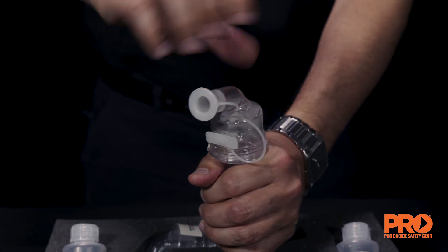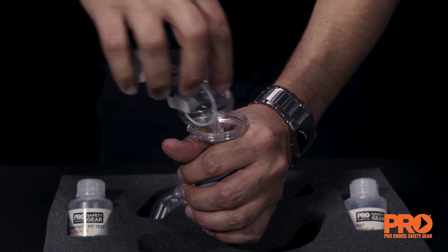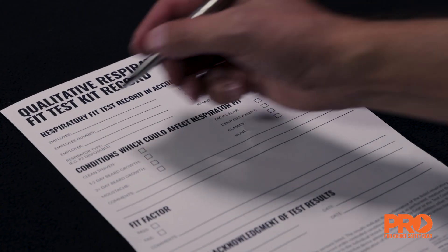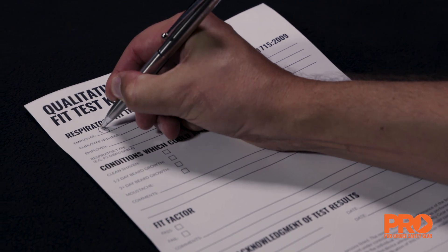Periodically check the nebuliser to make sure that it is not clogged. If clogging is found, clean the nebuliser and retest. Upon completion of the test, populate the respiratory fit test record and store accordingly.